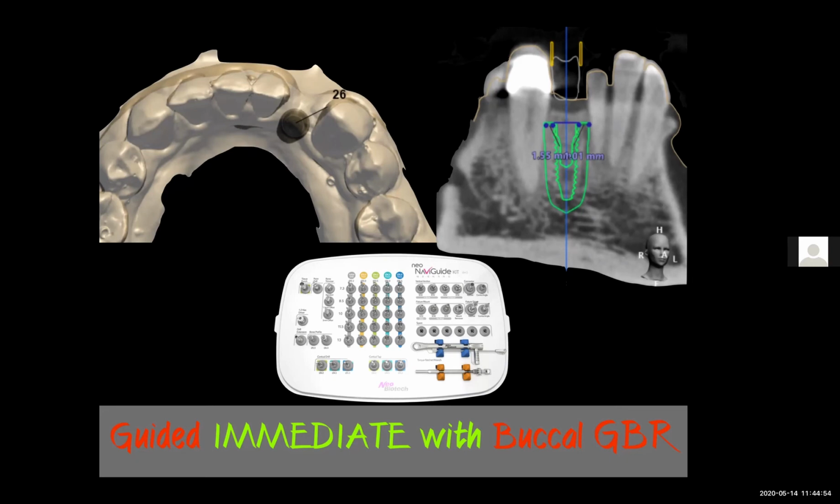Now I'm going to play the videos to give you an idea of how the surgery works with the Neo Biotech guided kit.